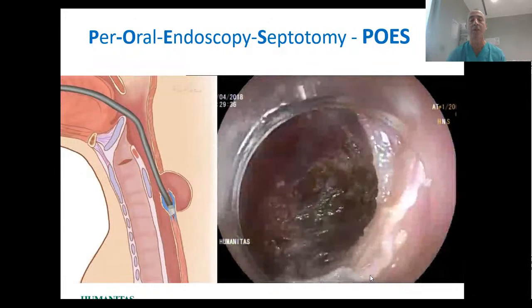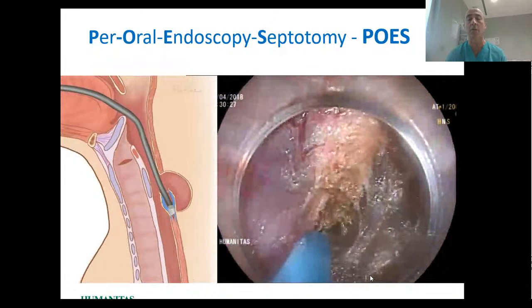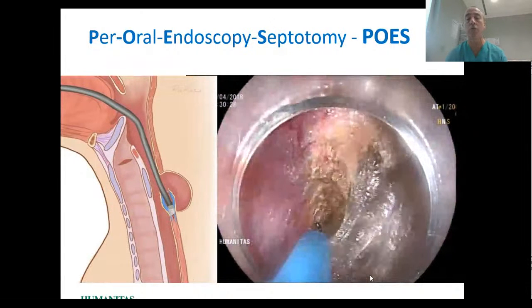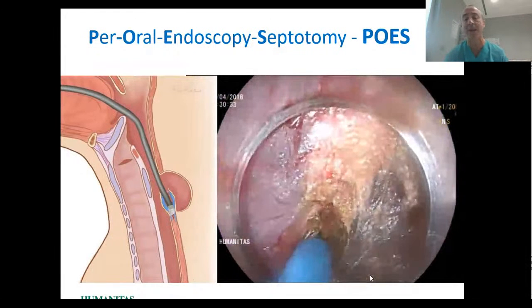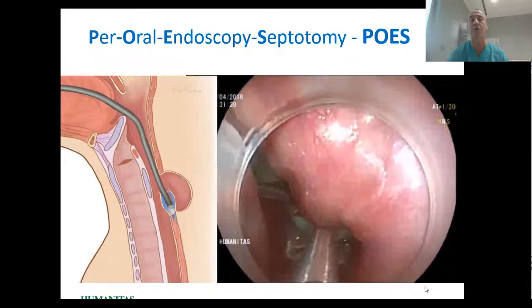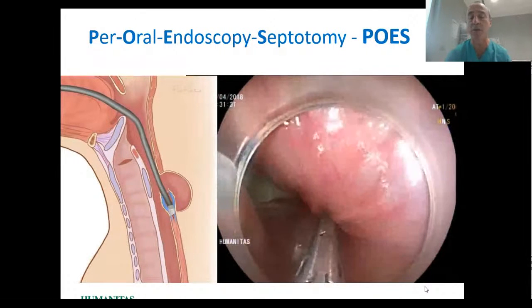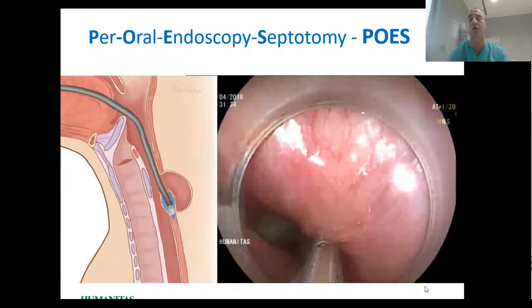You see, I have cut the esophageal muscle for about 2.5 centimeters. At this point, the esophageal muscle becomes thin, very regular, and there is nothing to be cut at the end, just a couple of clips, and the work is done. We do this as outpatients, so we discharge the patient the same day.